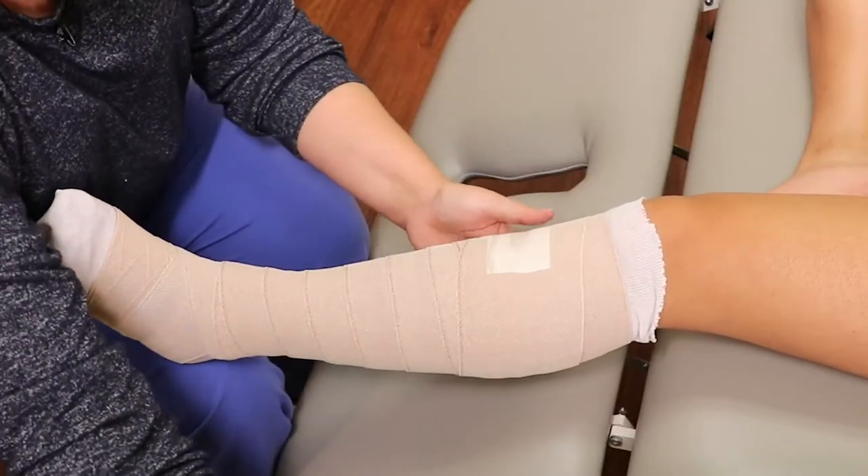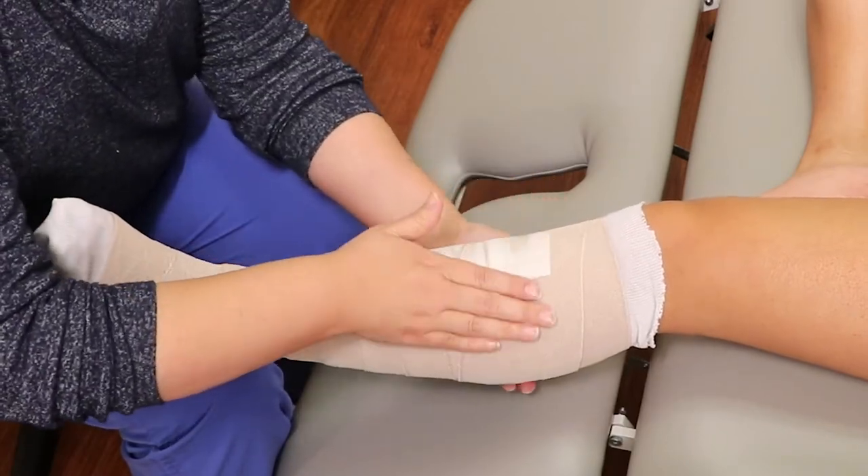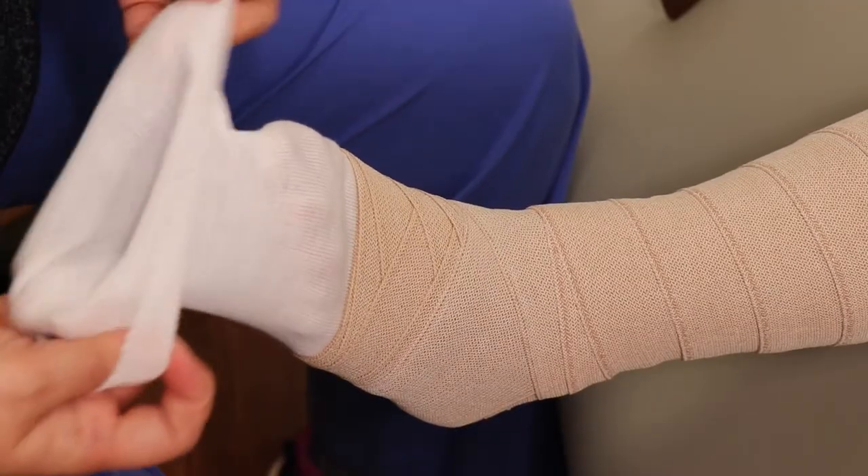Tape the bandage in place at the end and fold any extra liner down at the top and at the bottom.